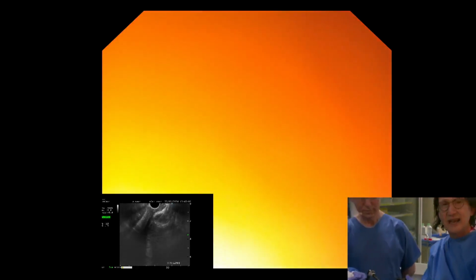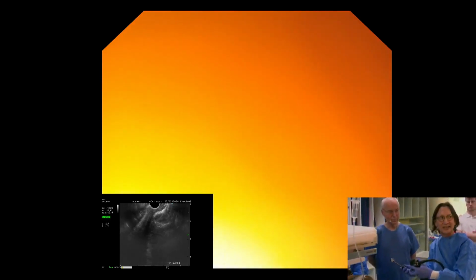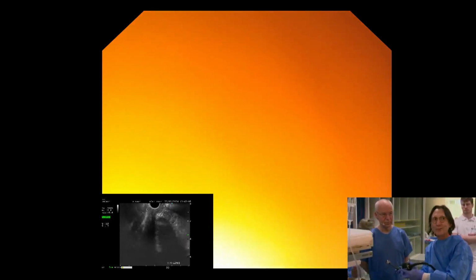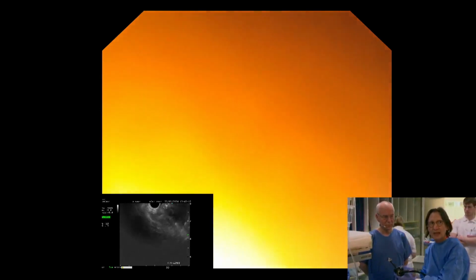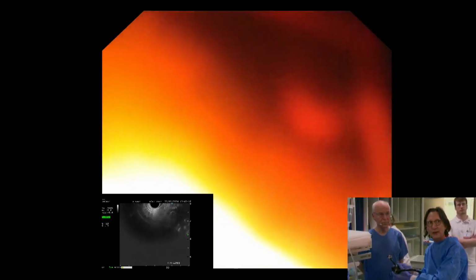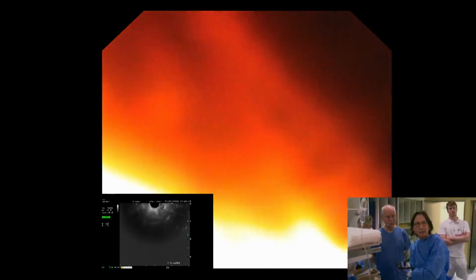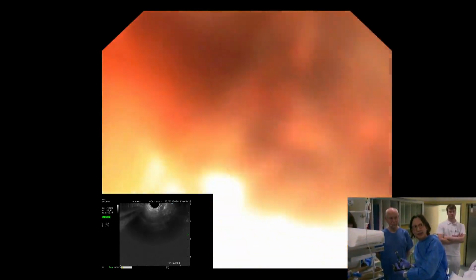I've unlocked. Oh, disconnect the cable. I did forget to tell her, as soon as you're in, you disconnect the cable. That's very important, so you don't accidentally step on the cautery and go to the opposite wall. So now I'm pushing very slowly out. And I'm looking for, there it is. I'm pushing it out.